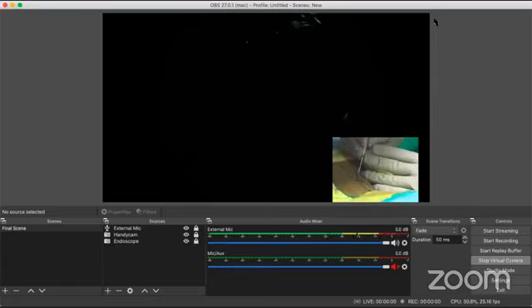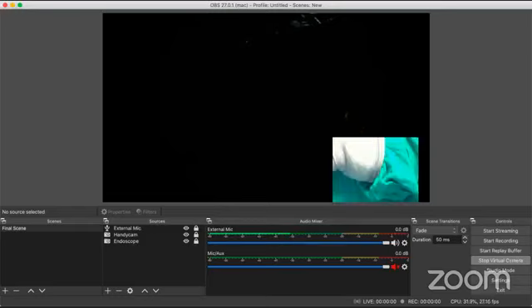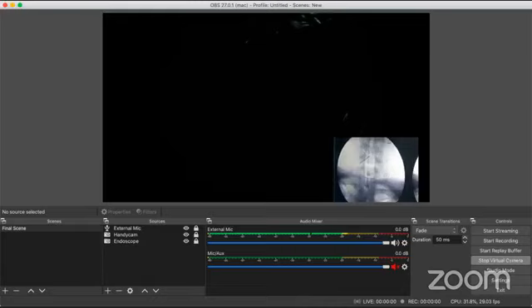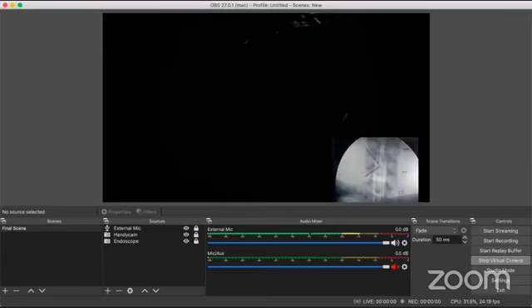So what I'm going to do is, now I'm going to show you two things. One is when I mark my needle to the spinolaminar junction. Shoot, please. See, it's gone almost to the spinolaminar junction. Shoot, please. Yes. Next needle. Now I take a needle from here, from my marked point, and I go to the spinolaminar junction here, please. Shoot, please. See, both the needles meet on the disc surface. They're not deep. They've gone superficial. Don't worry. Okay, the neck is quite deep, so we are not worried about it. Now, that is one point that I want to reach.